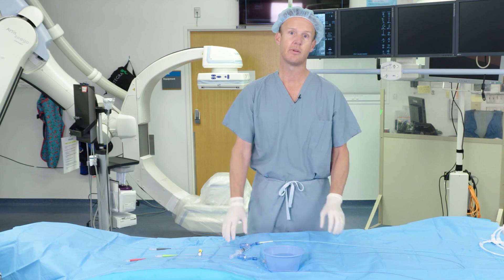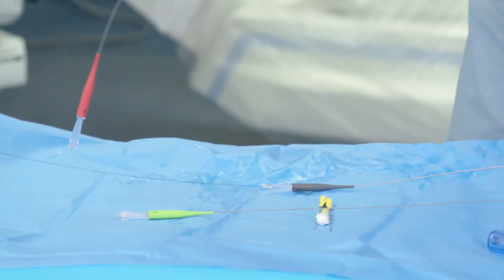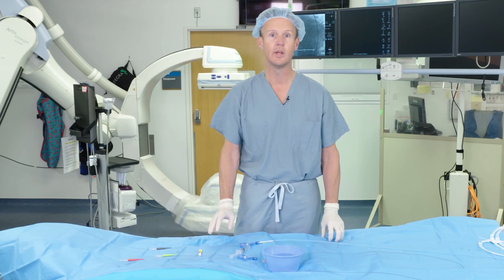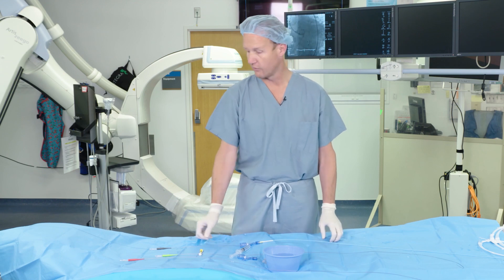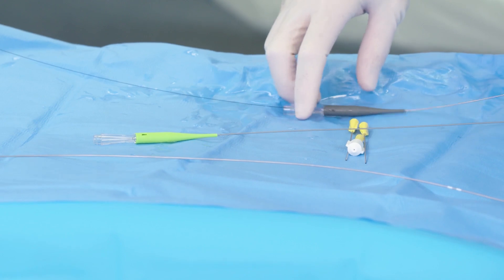There are three catheters in the Mamba family. The first is the Mamba, which is used in antegrade cases where you need a lot of support. The other two are the Mamba Flex — a short Mamba Flex and a long Mamba Flex — which are used more for retrograde cases.